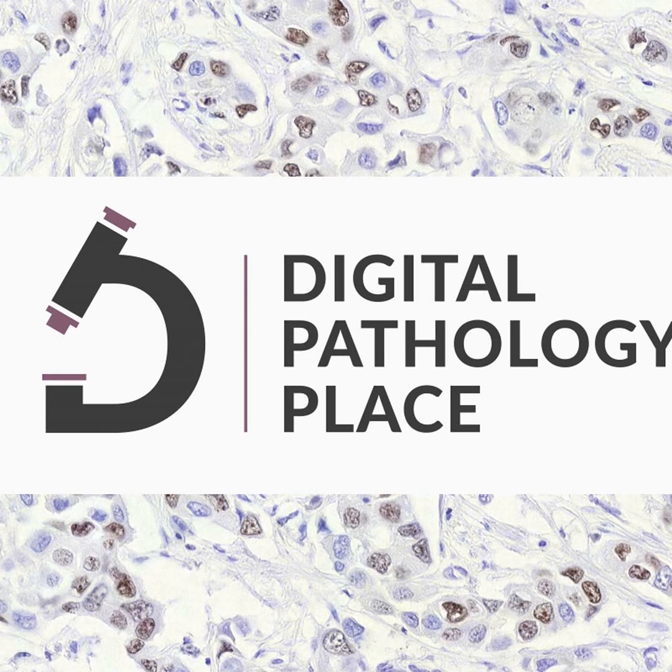So another super important aspect in all these deep learning efforts is explainability. And I remember from the paper that you said the model flagged patches, and that it maybe has better explainability than other models. The reasoning for that would be that the model took the information about mutation prediction from certain patches, and then pathologists looked at those patches and said, yes, this is compatible with the histopathological features associated with the mutation.